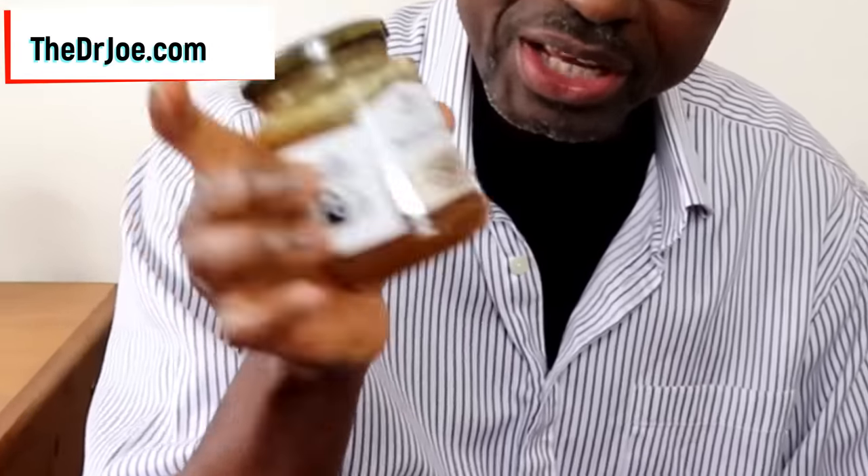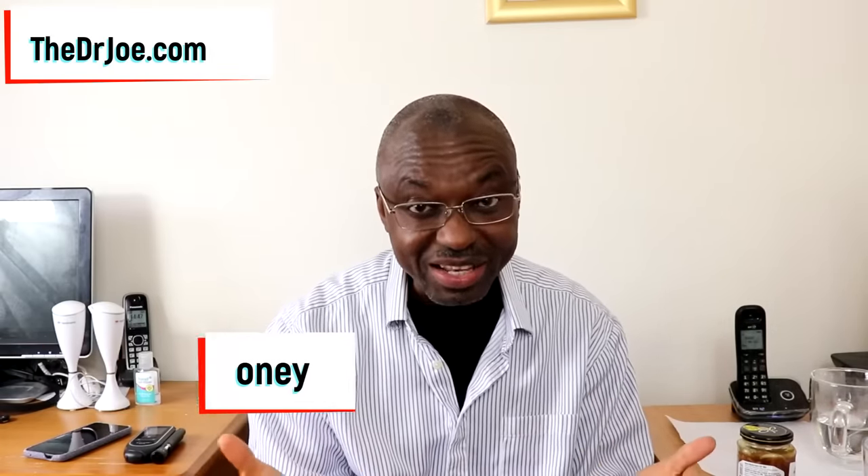All I'm going to do here is a simple before and after test. The before is going to be checking my blood sugar with this monitor here — this is a blood sugar monitor. The reading we get is going to be the before result, and then I'm going to take a spoonful of this Manuka honey here, which is supposed to be one of the best honeys anyway. We'll come back 30 minutes later to check my blood sugar again, and that's going to be the after test.